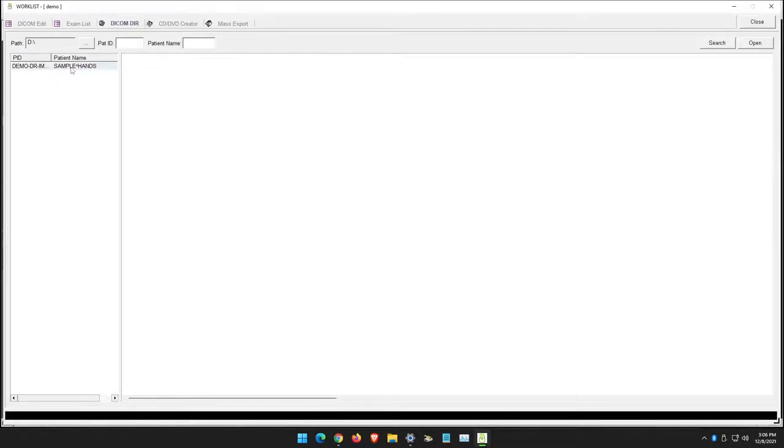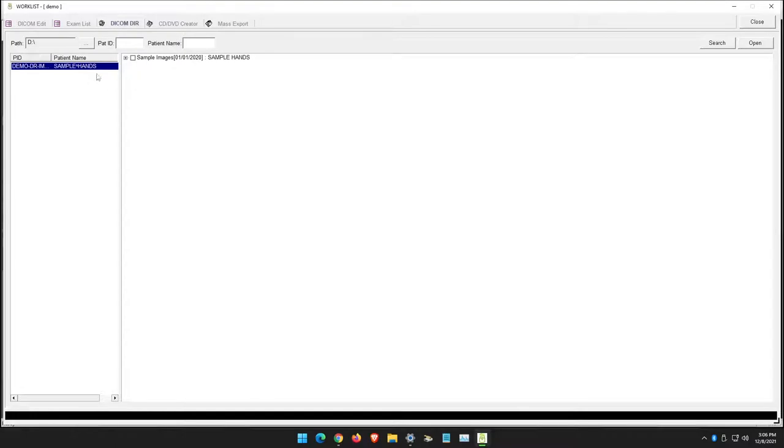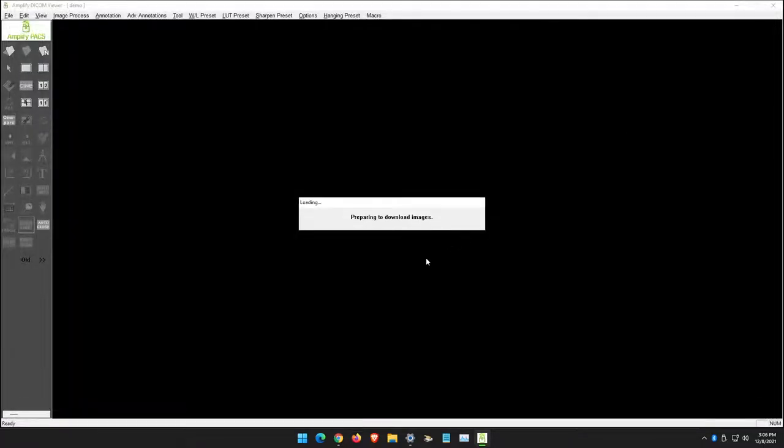It will display the patients that are on the CD. Then you can check the box for the exam to open those images.